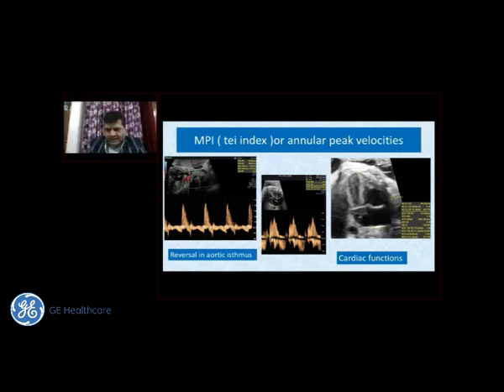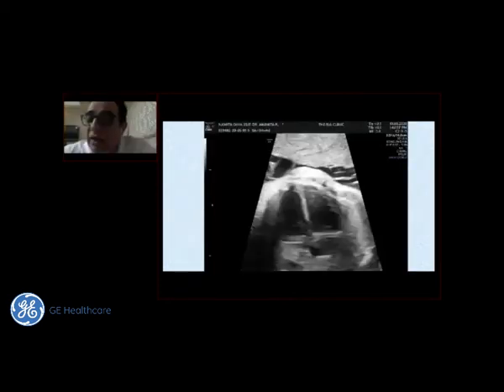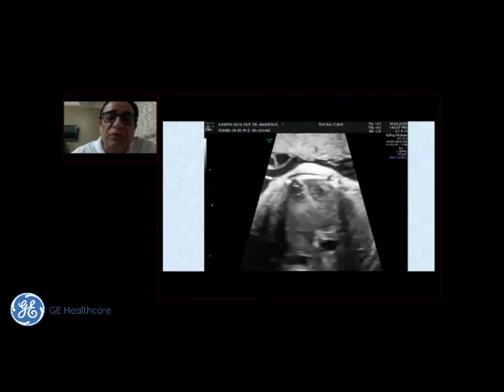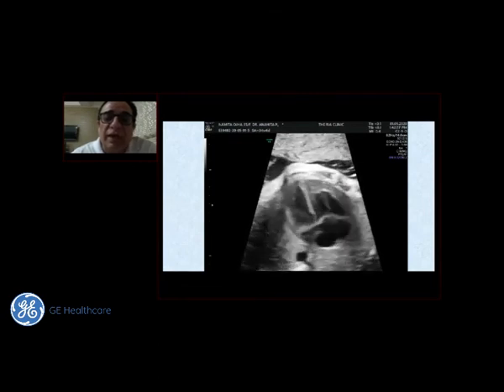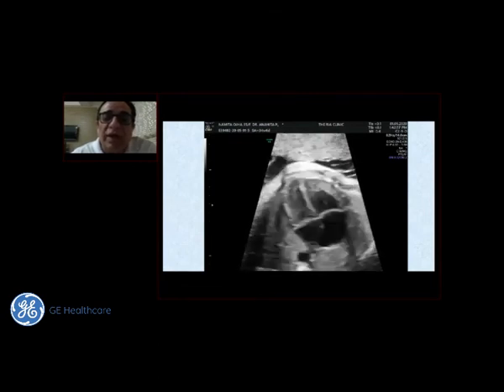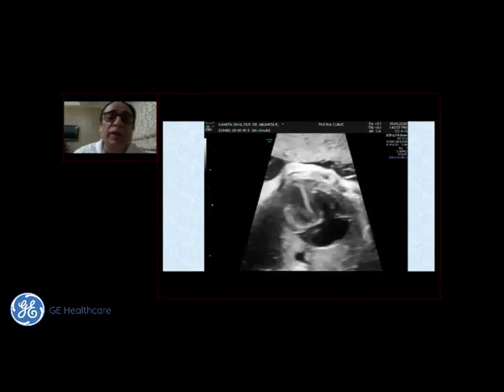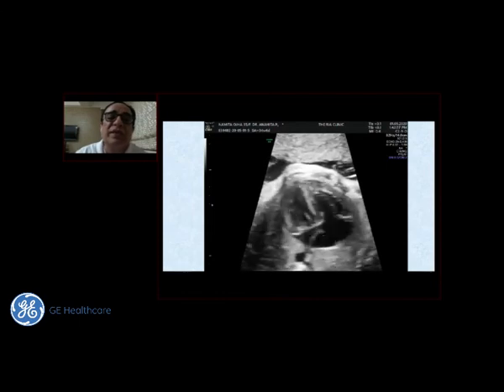Yeah. So we have observed cardiac changes in FGR, and there are situations where you can see here the left ventricle is small and the right ventricle is dilated. Now we need to analyze the functioning of the heart. So sometimes even where this is already, you can see 34 weeks, 6 days.